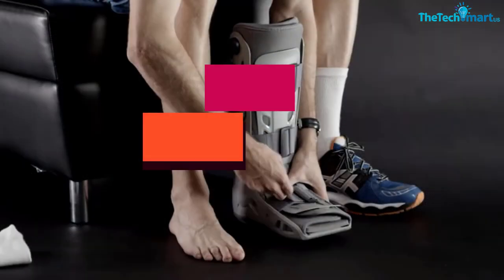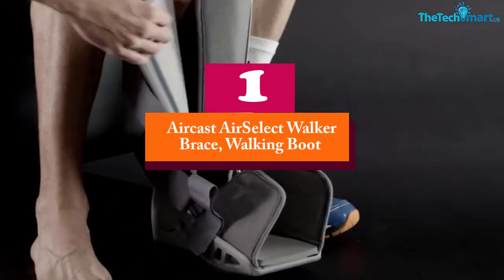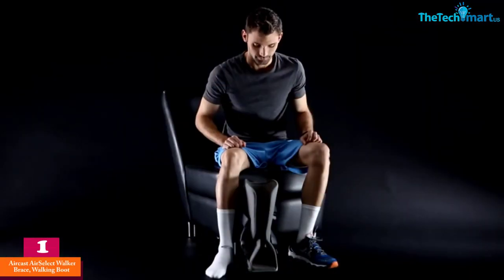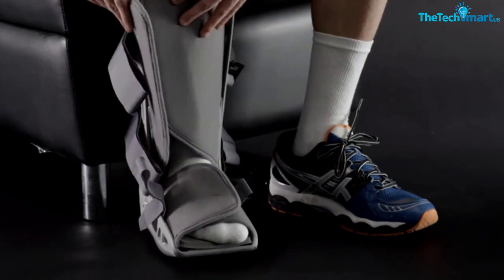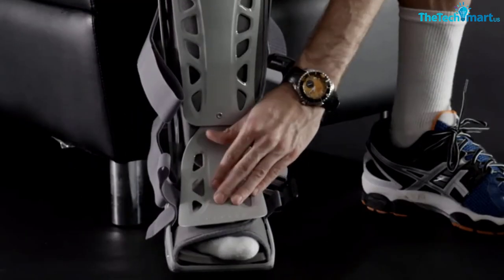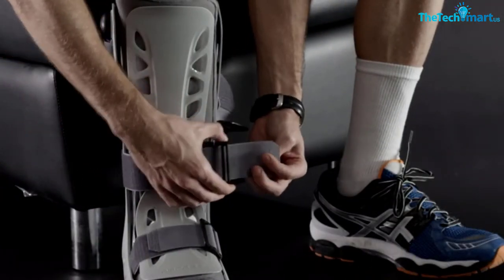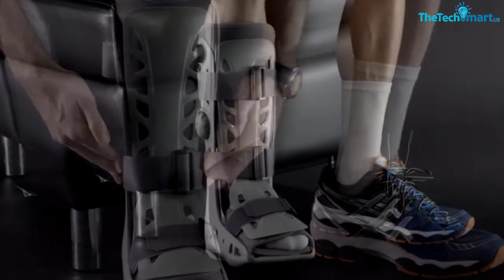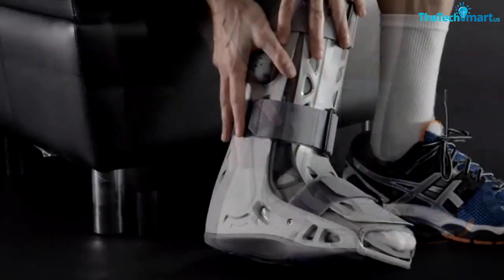And finally at number 1, we have the Aircast Air Select Walker Brace Walking Boot. This cam walker boot consists of a semi-solid shell, therefore offering exceptional durability. Moreover, the leg brace comes with a universal fit to offer a comfortable fit for individuals. This standard-sized walker boot delivers full shell protection to your leg and foot, and the open frame and slim profile design keep your leg comfortable and breathable.